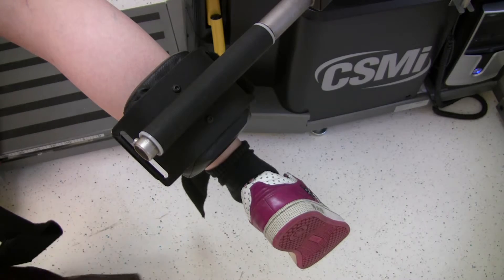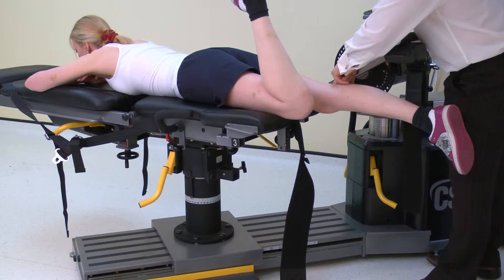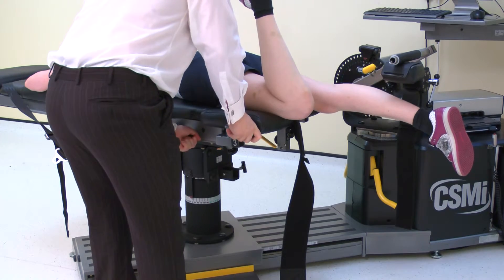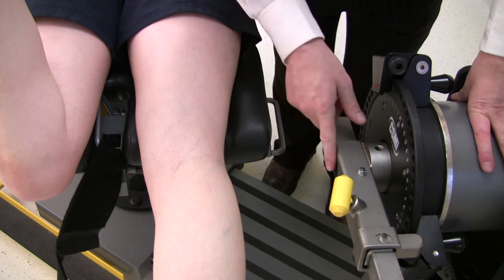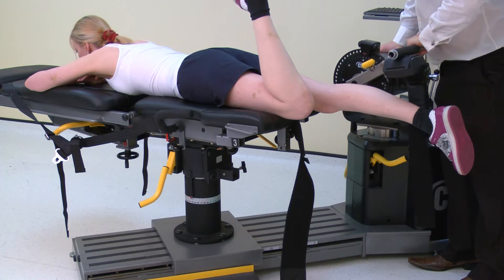Next, adjust the monorail so that the shin will contact the calf pad in the center. Now the axis of rotation needs to be set. The axis for the joint needs to be directly opposite the black dot on the input arm. The axis of rotation for the knee is the lateral femoral condyle, or the lateral joint line. The chair fore-aft and the dynamometer height may need adjustment to achieve the alignment.